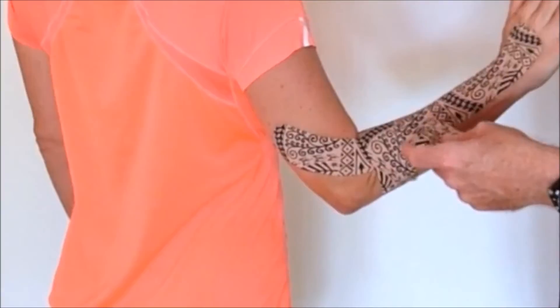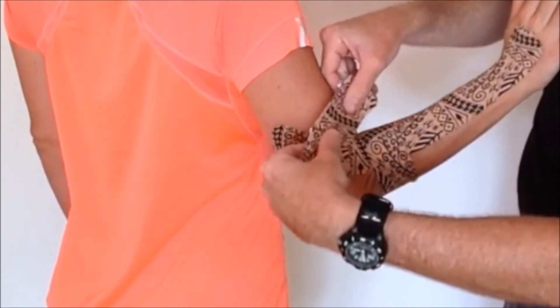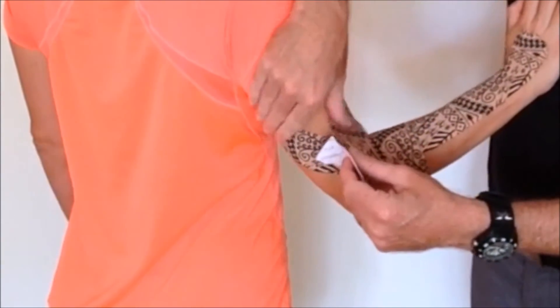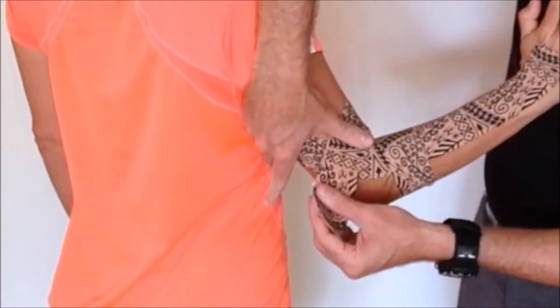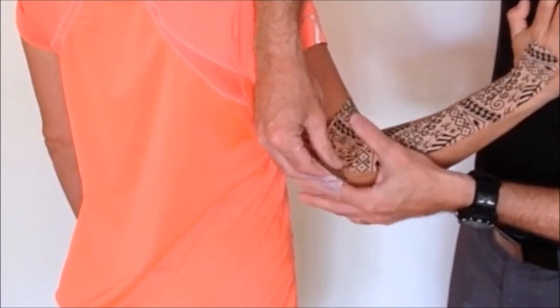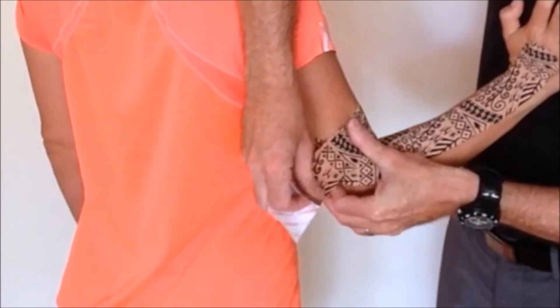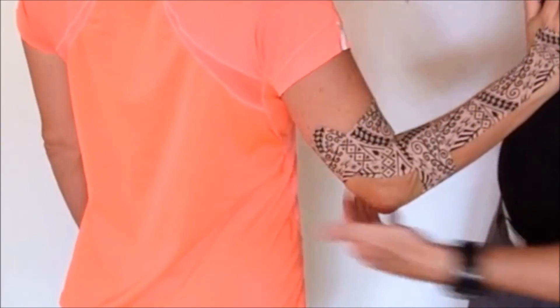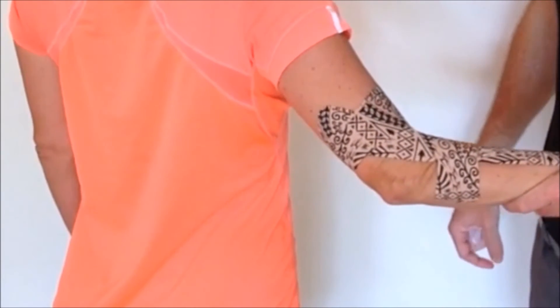Let's have a quick look at that. Now doing the same again but this time above — we're going to start at one end, not in the middle. I've got them in the short position once again. I'm going to use my thumb, swap my hands over, and pull all of this soft tissue using my fingers back in this direction to bunch it all up. Take up my tension but keep my anchor point pressure and then relax, so I get this really nice unloading of all of that soft tissue through that entire region.